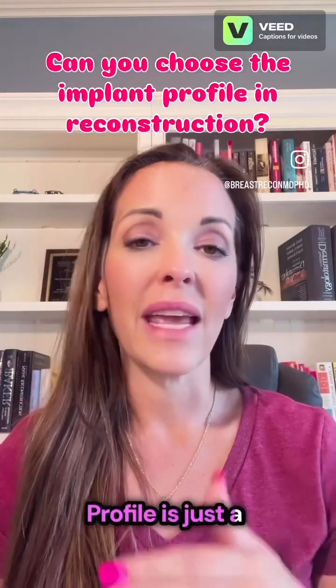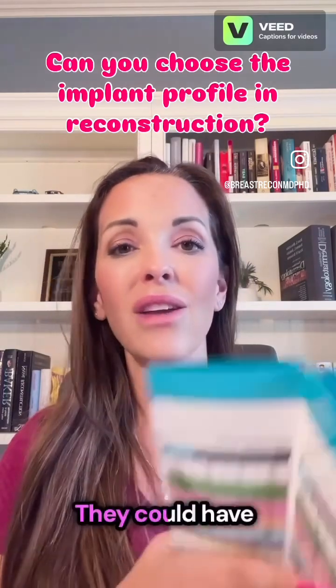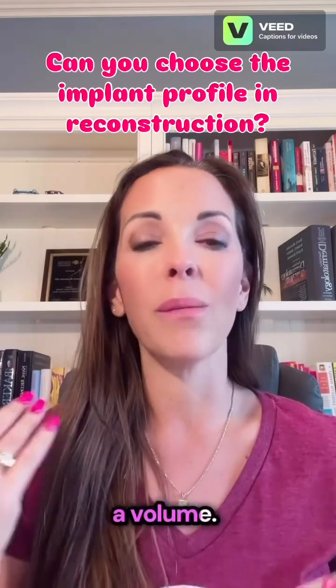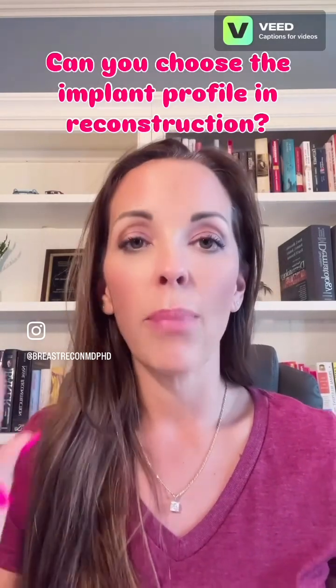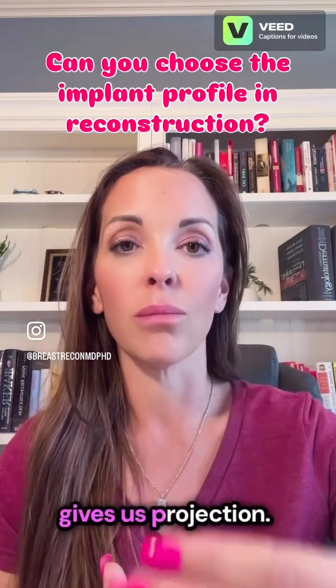Profile is just a subjective term that implant manufacturers give to implants. They could have literally not even used the profile. They could have just had a base width and a volume. And this concept can be very confusing to patients. But remember, base width, volume gives us projection.